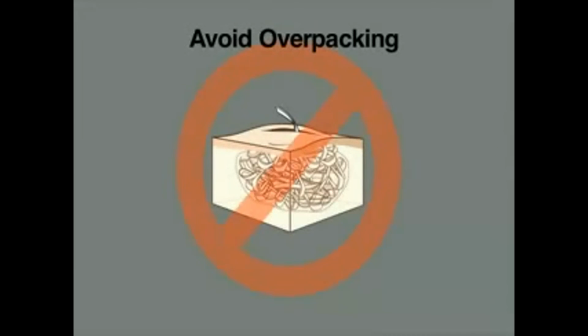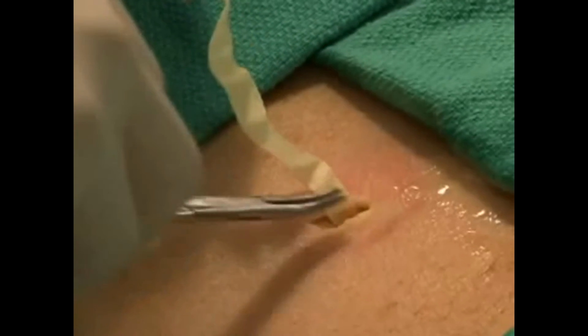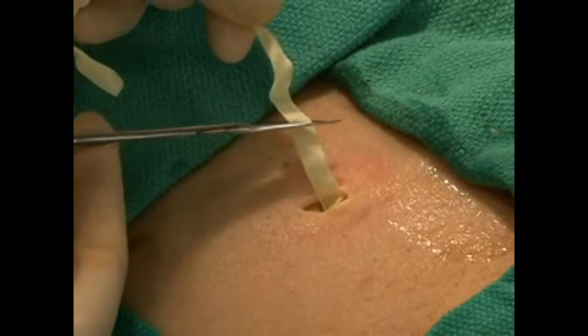Overpacking may cause ischemia of the surrounding tissues or interfere with desired wound drainage and should be avoided. Appropriate packing will allow healing by secondary intention and avoid premature closure of the wound, which can lead to reaccumulation of bacteria and recurrent abscesses.